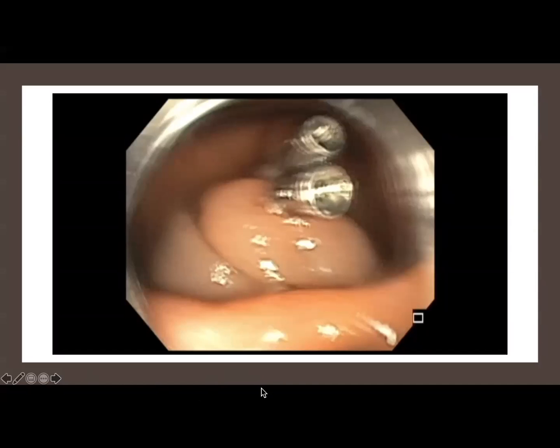Any comments, Sylvia? I would like to ask a quick question. I don't recall well how many polyps did this patient have cumulatively? I recall 3: the 8 mm, which was resected, 10 millimeter, and 20 millimeter. So only 3 lesions so far. Okay, because my question is, in this situation, a lady in her 60s with serrated polyps in the proximal colon, it's always a question mark for me. Is this a serrated polyposis syndrome?